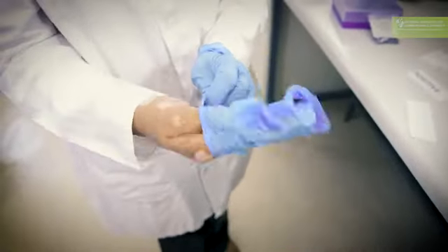So to start the test, you have to first ask the patient which hand they use, and you use the non-dominant hand. So for example, if the person is right-handed, you always take the test from the left hand. Once you've selected the non-dominant hand, you select the finger. You can use either the middle finger, the index finger, or the ring finger.